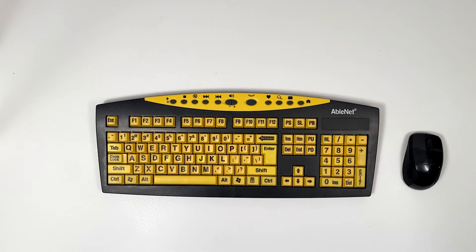Hi, I'm Jim from AbleNet and today I'm going to show you how to get started with the Keys-U-See keyboard and mouse.